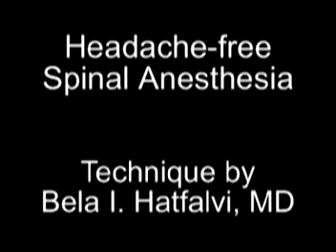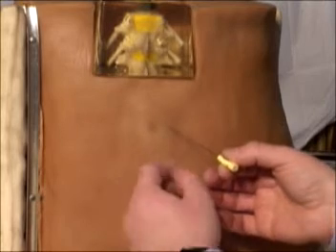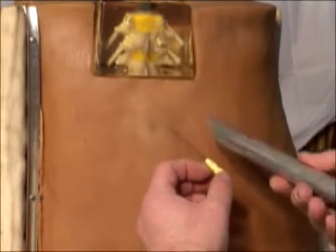The most important aspects of this spinal anesthesia technique are the proper placement and orientation of the needle, the type of needle, and its angle to the skin. We are using a 22-gauge Quincke needle.